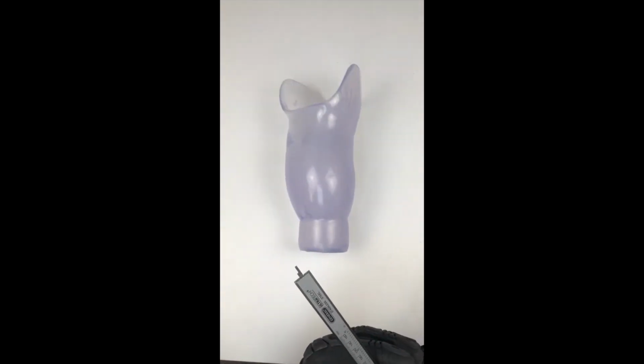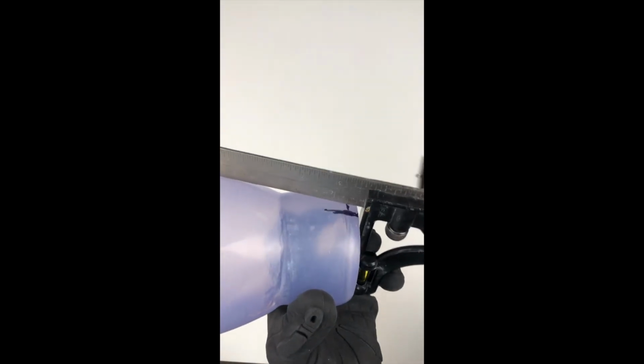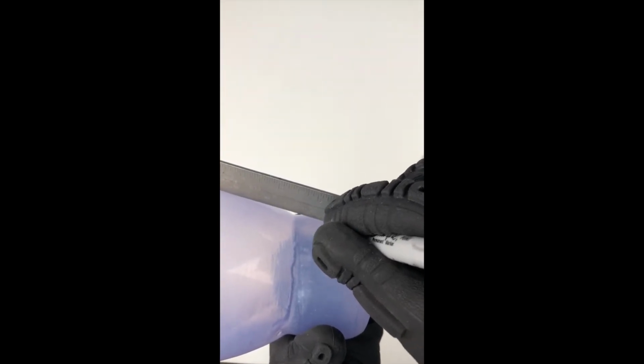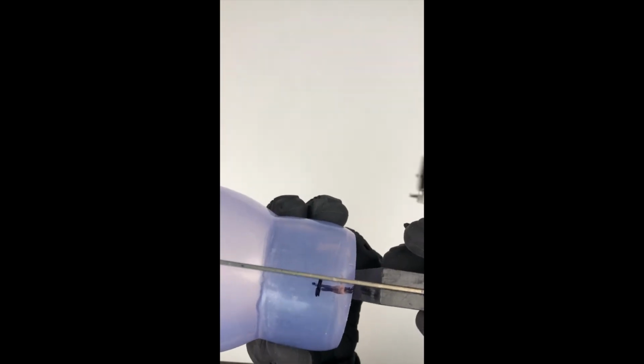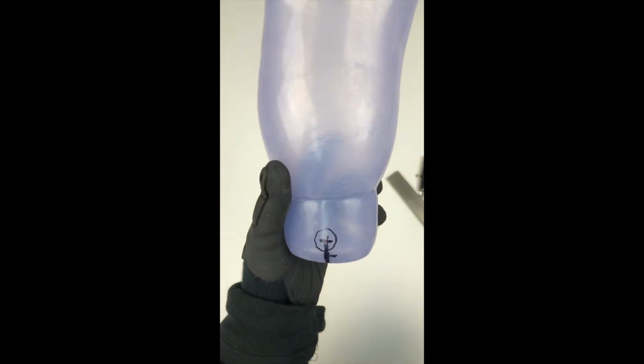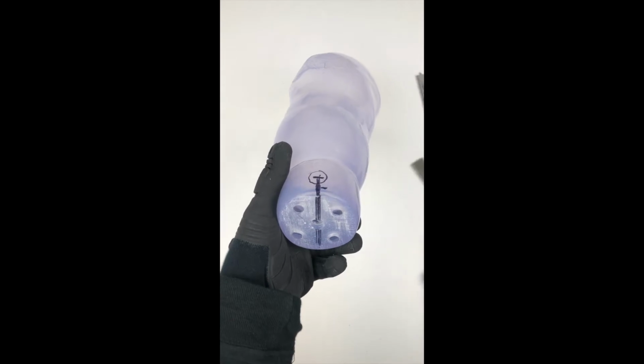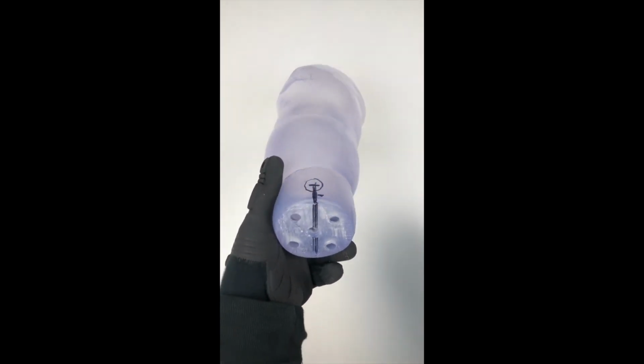Insert a caliper to determine the distal socket thickness. Measure from the distal end of the socket, adding the distal socket thickness plus 3/8 of an inch to determine the center point for the charger hole. The charge port hole should be on center between the Euro 4-hole pattern. This hole will work for your distal puck charge port as well as the air puck valve port.